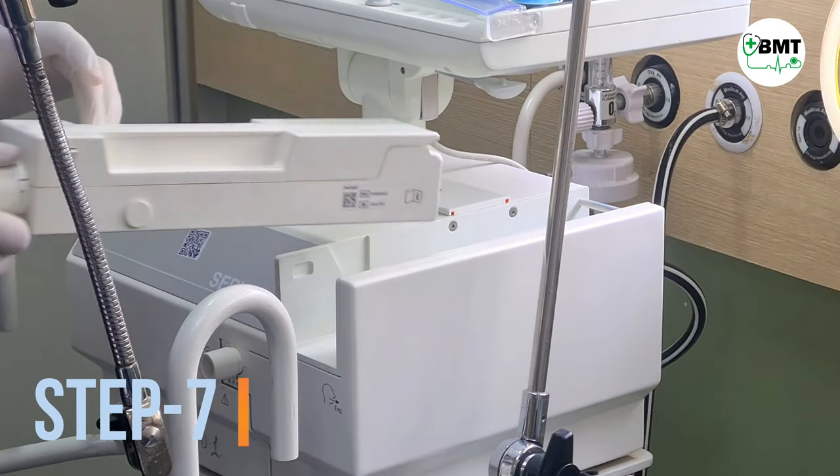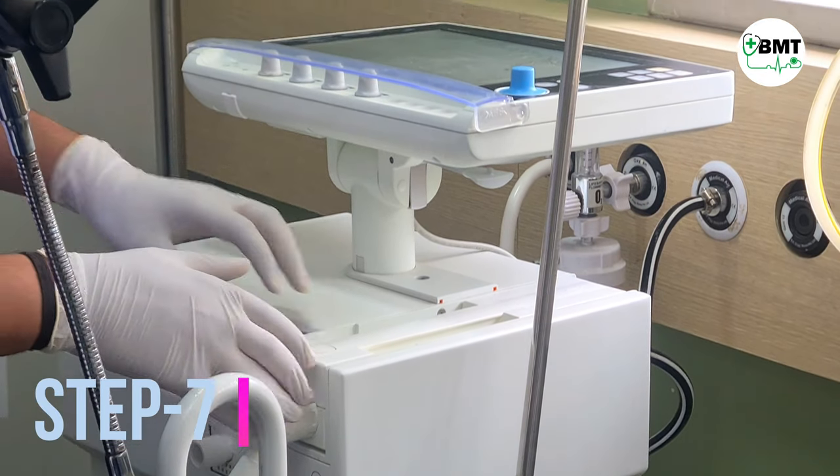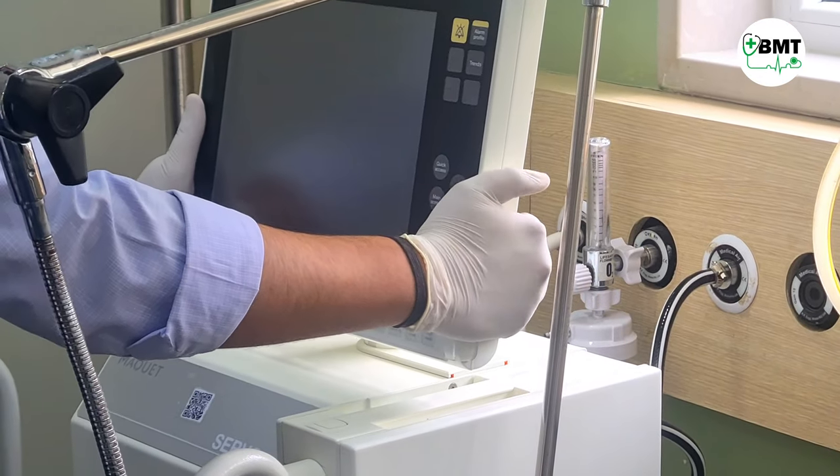Step 7. After making sure it is completely dried, fix the cassette back on the ventilator.